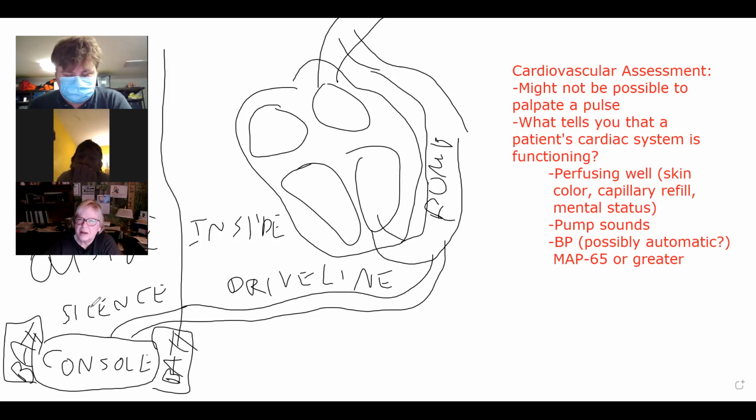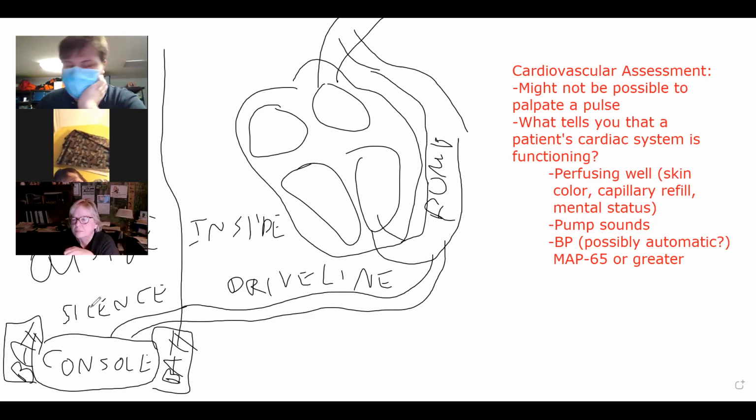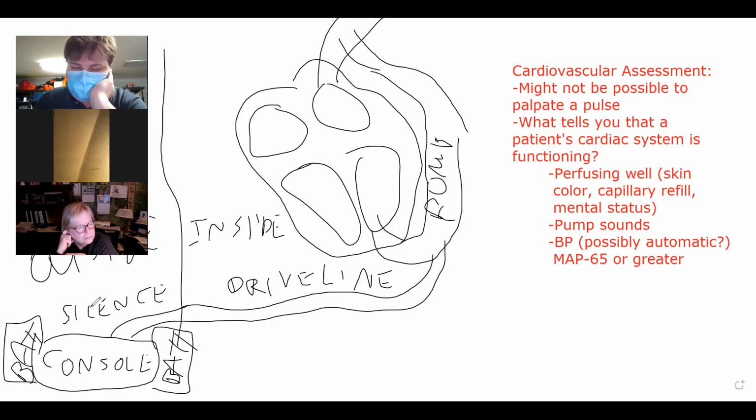So if someone has an LVAD, an issue with this unit, it's going to be a transport to Dartmouth or Fletcher Allen? Yes, so here's the way they divide it up. It really comes down to, is it a problem with the patient's cardiovascular system, and more likely a problem with the LVAD, or is it something else?